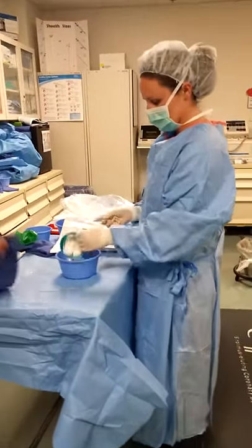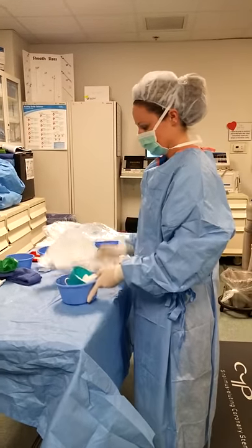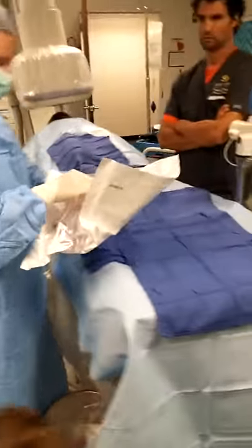Manifold, clips, gauze, little bucket, 10cc syringes, big bucket. That's what you'll be doing on the first day.